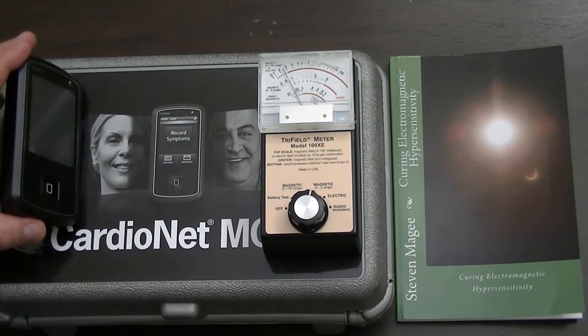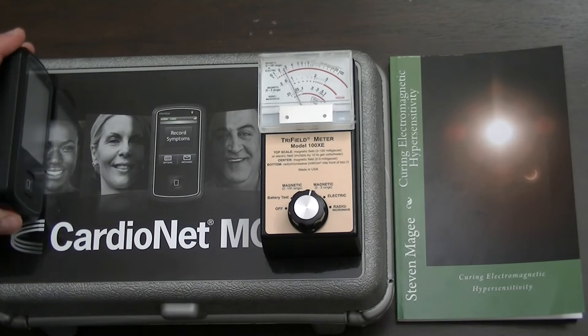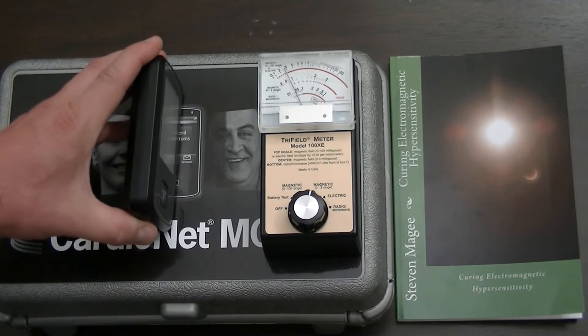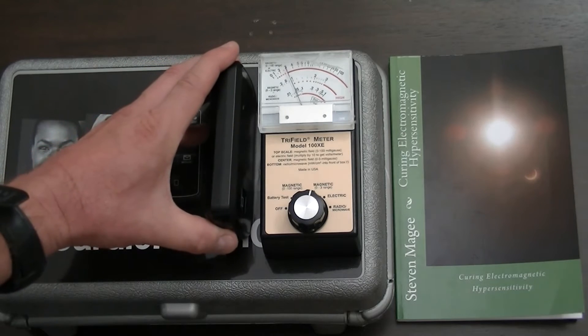Let's try it on the 0 to 3 range and see what happens. On the 0 to 3 range we're actually picking up on the device from about six inches away. Let's bring it close — we're off the scale now.